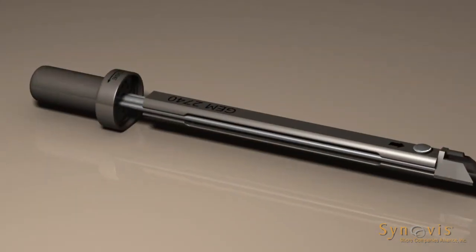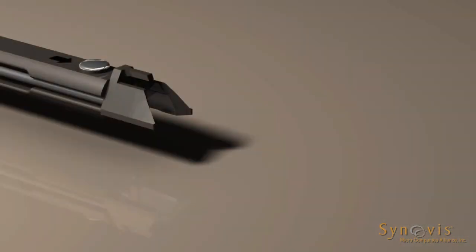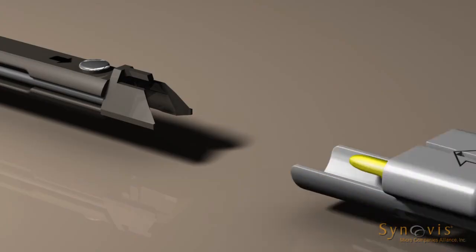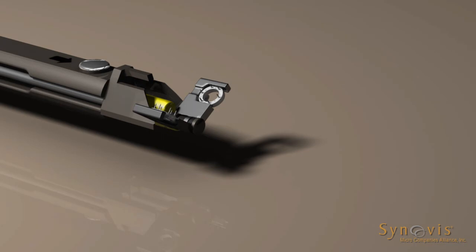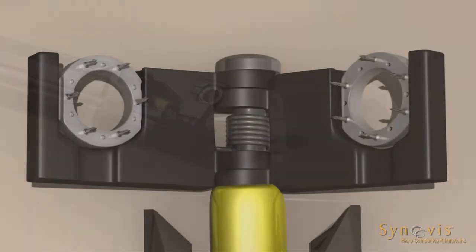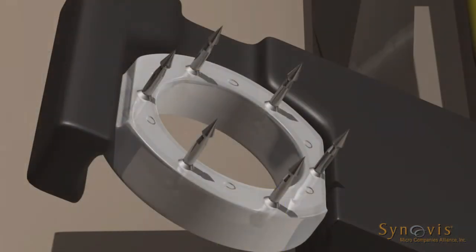Turn the anastomotic instrument knob fully counterclockwise. Insert the coupler into the anastomotic instrument. The matching indicator arrows on the coupler device and the anastomotic instrument should be pointing toward each other when loading. Ensure that an audible click is heard for proper loading. Remove the coupler device from the protective cover. Visually inspect to confirm that both rings are seated at the bottom of the U portion of the jaw.